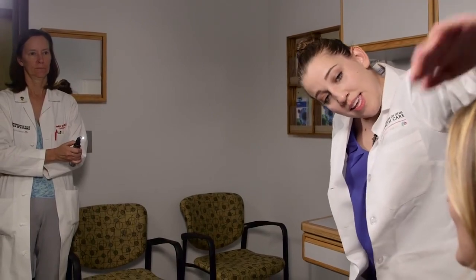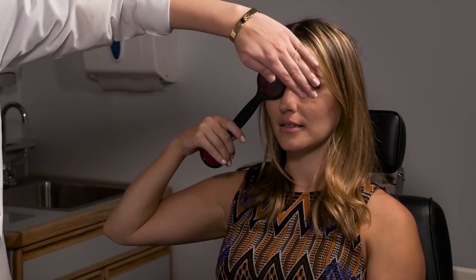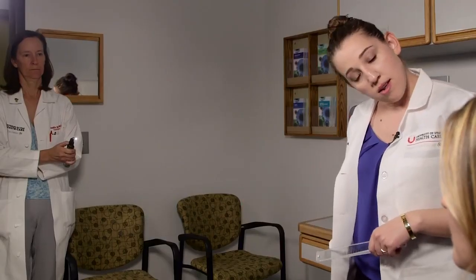So let me have you hold that up over the right eye, and you have your assistant hold a muscle light down at the end of the room. So can you appreciate that there's a horizontal red line when you're looking through your right eye? Yes. You can kind of rotate that to make it perfectly parallel with the floor. Okay, so when you're looking down at that white light, is the white light above or below the red line? Or right on? Right on it. So she's very well aligned. So the light and the line are at the same level.